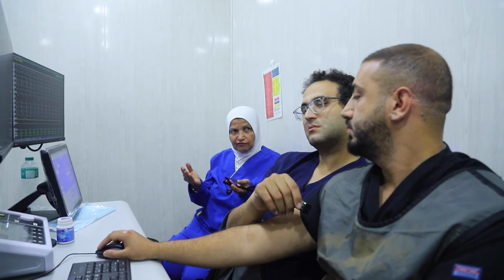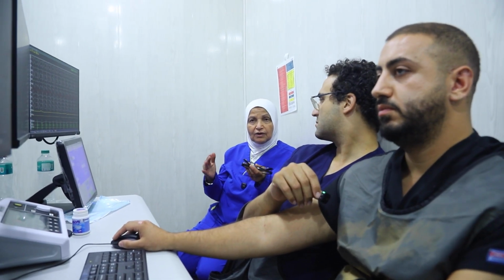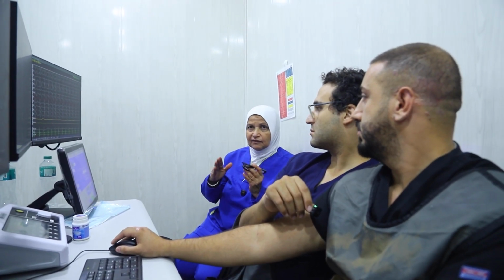But remember, PVCs can deceive you. ECG does not give you the full answer, so you have to be ready, right side, left side. Don't waste your time. If you get edema, you might be confused afterwards. Remember that the RVOT is a thin structure. Don't go high, and you have to watch the contact force, the impedance, the temperature and the flow. We went to 50 watts in the right coronary cusp, because you can go 50 watts there.